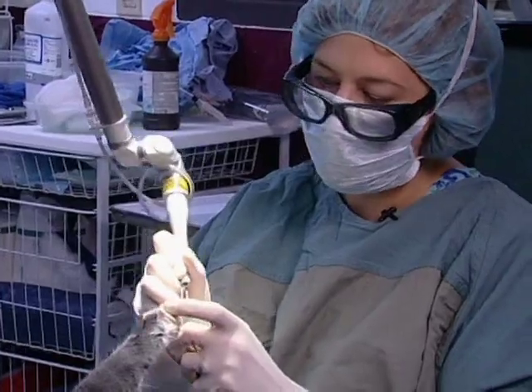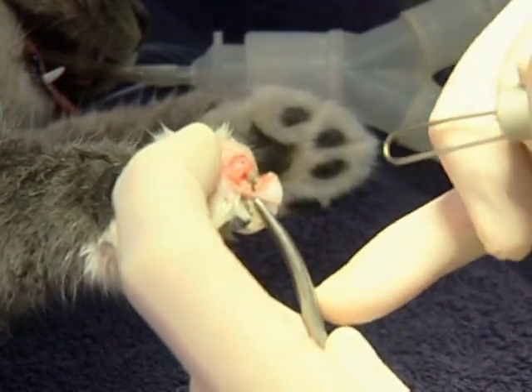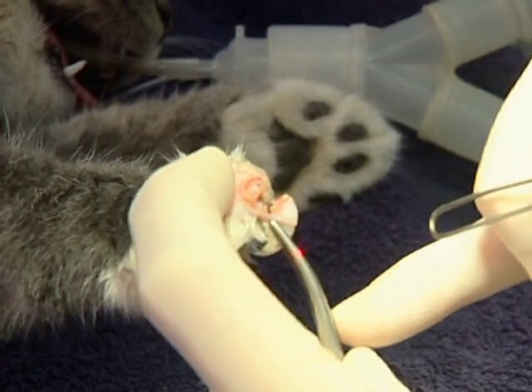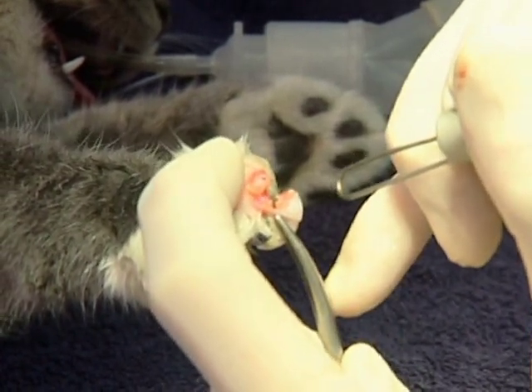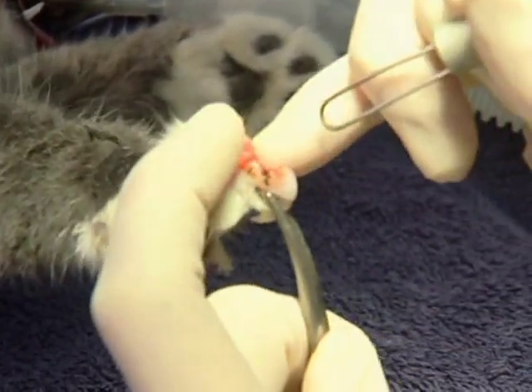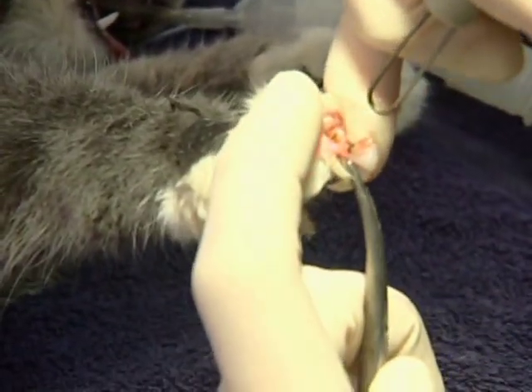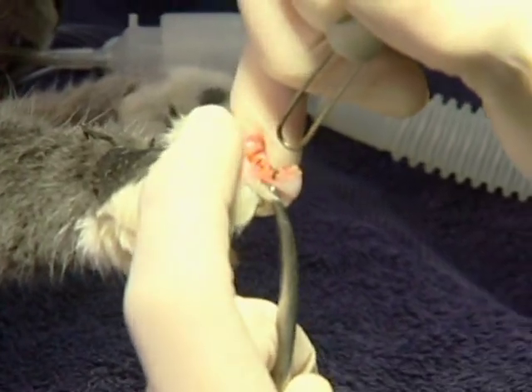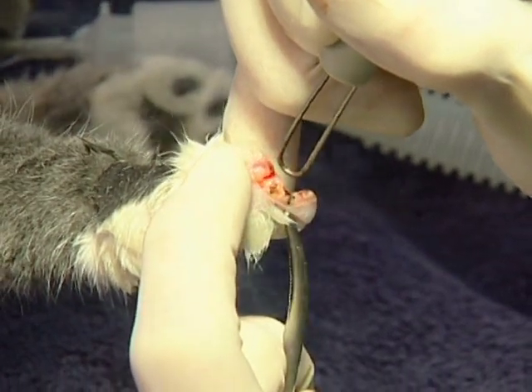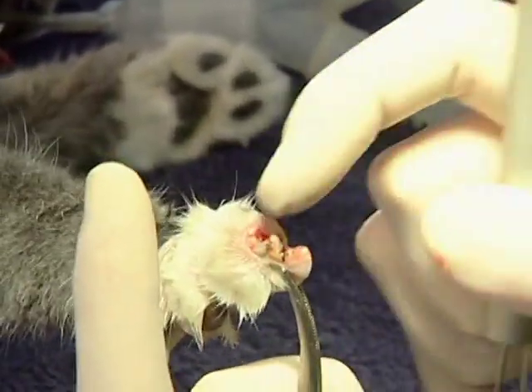You have to do it on both sides. On this side, you can visualize that collateral very nicely. Can you appreciate there's a white band of tissue connecting P2 to P3, right there, right where my red diode is? I'm going to aim right at that tissue, and as I do, you can see P2 sinking away. The third cut — the first one was the dorsal ligament collaterals — this is going to get our deep digital flexor tendon. I call it my little smile. I'm going to come around the back of P3 and release that deep digital flexor tendon. When you do, P2 falls away.